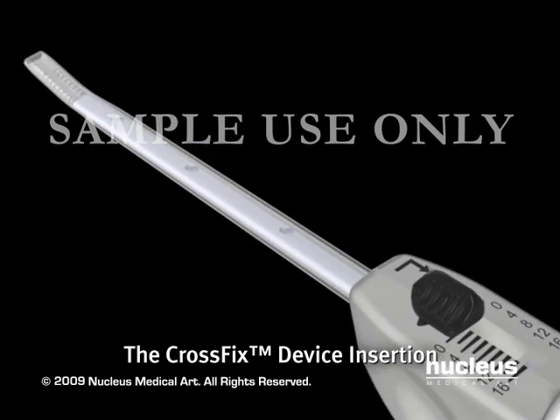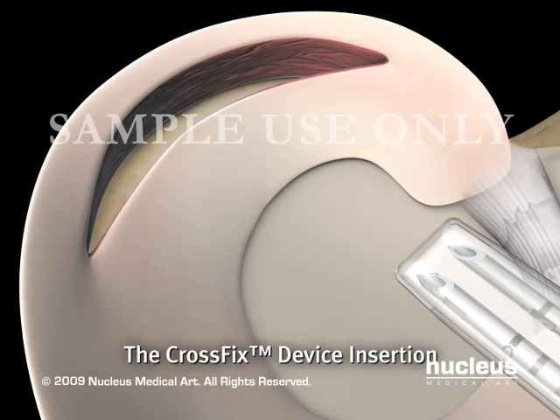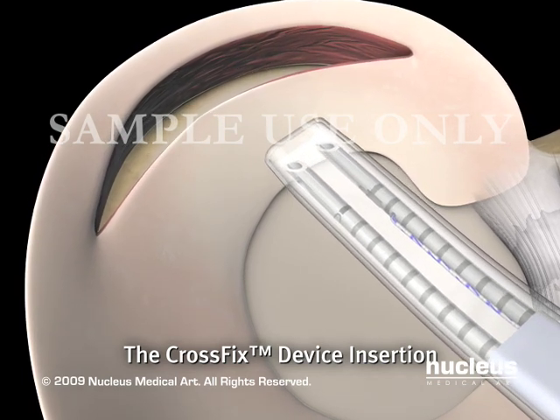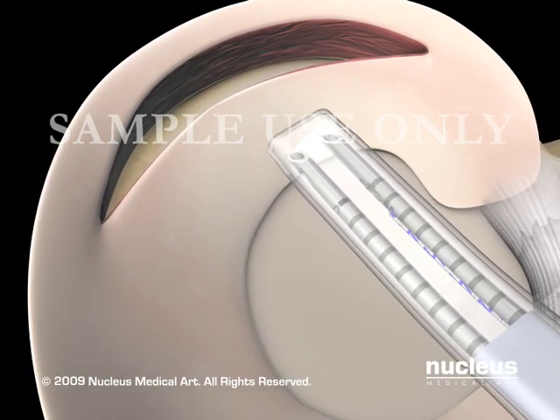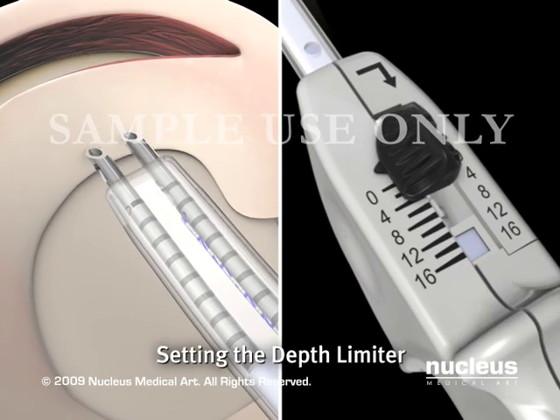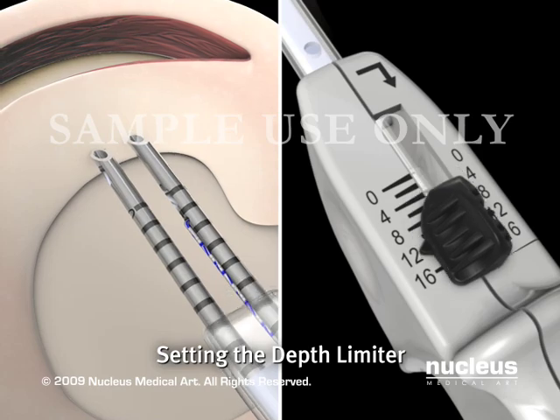With the depth limiter fully extended, the delivery needles are inserted into the joint space and positioned for repair. Based on the preferred meniscal entry point of the device, the depth limiter is retracted to the desired distance by moving the black lever to the right and then down.